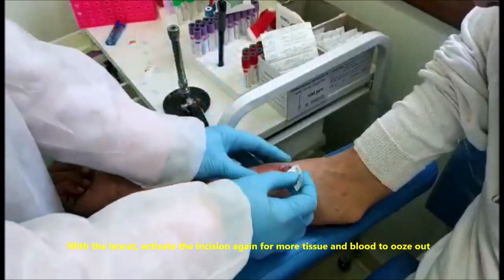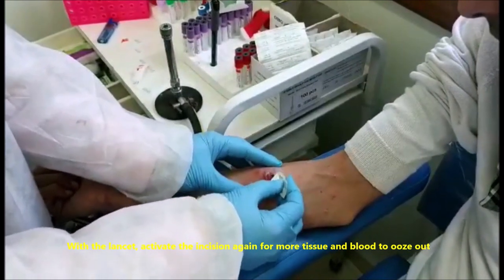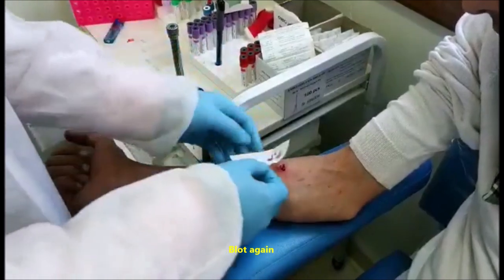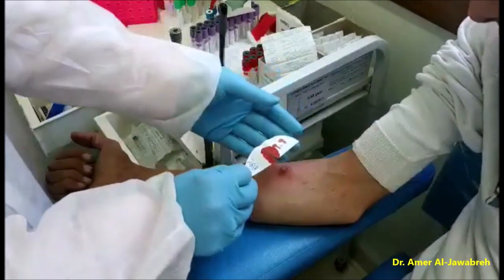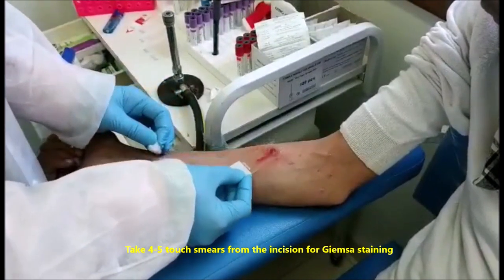With the lancet, activate the incision again for more tissue and blood to ooze out. Blot again. Take 4 to 5 touch smears from the incision for Giemsa staining.